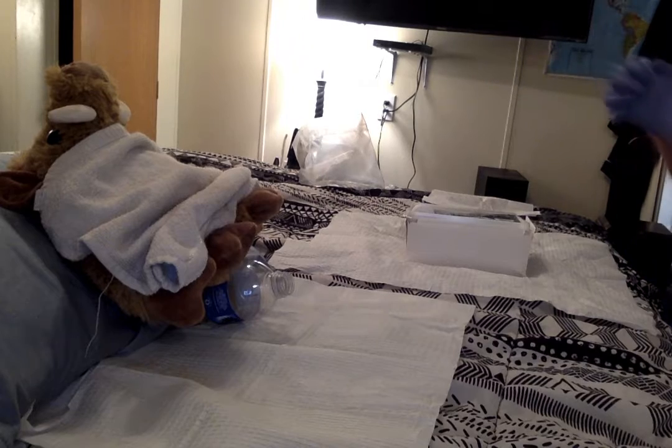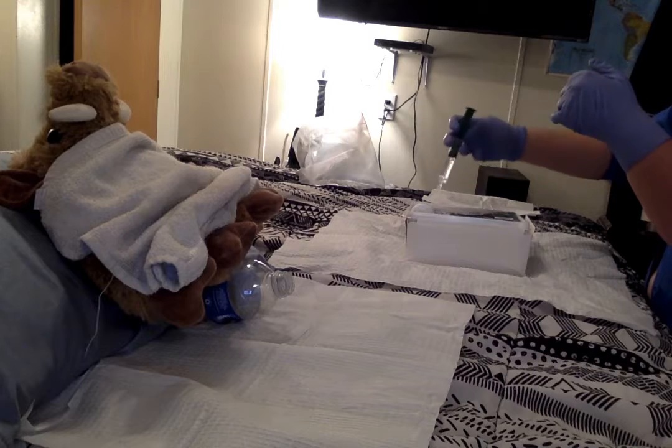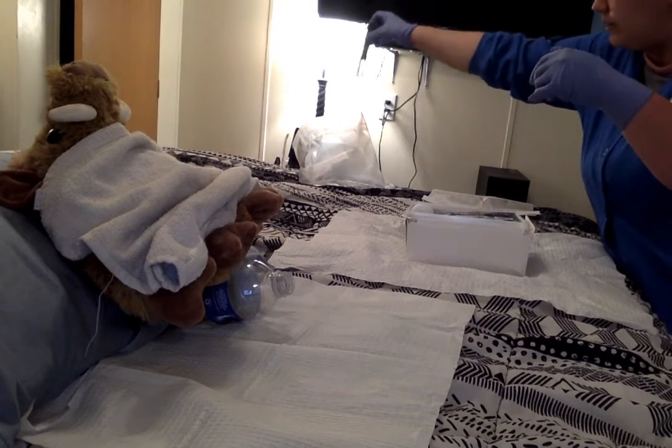Okay, now the next thing we're going to do is we are going to grab our lubrication. We're going to squeeze that out onto our sterile field. We're going to throw this in the trash.